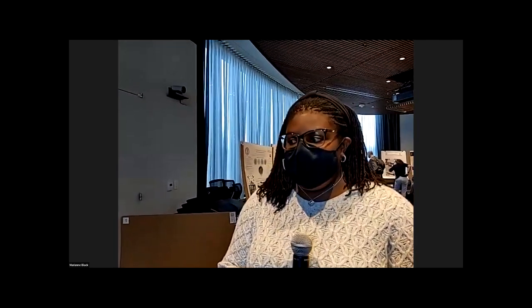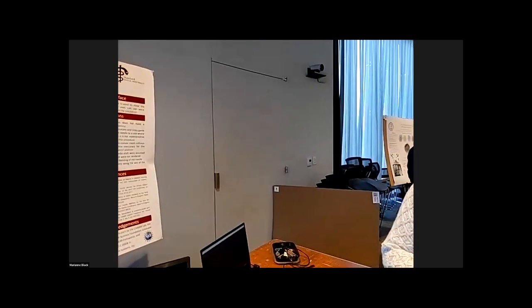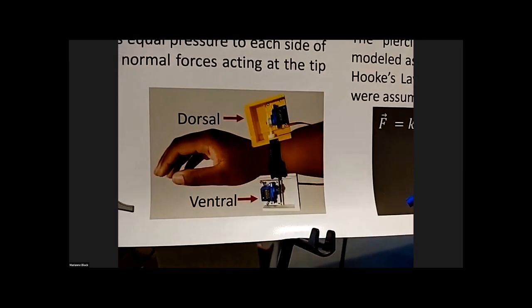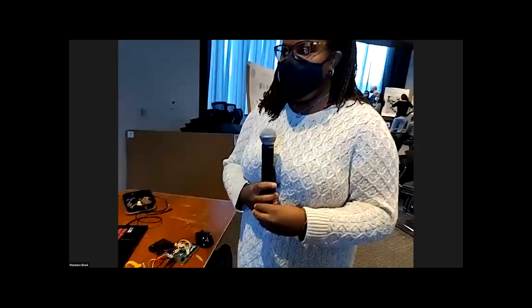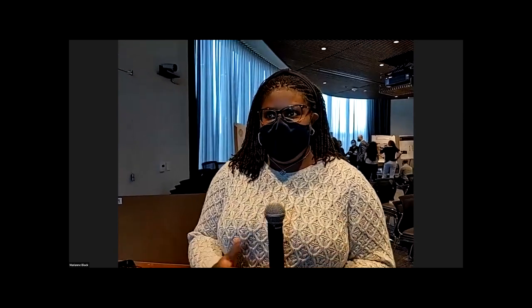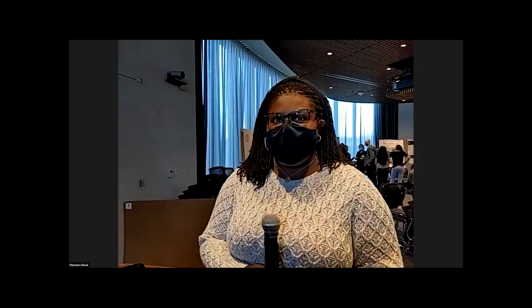I'm also looking into different ways to mount those devices I showed you to be more wearable and more robust. And then I've also looked at other types of devices that provide shear forces to the skin, so that you can add another degree of freedom of feedback. And also I've looked at devices that add torsional degrees of freedom to the skin. Those are still in development, and whether I have the model to accurately determine what forces go to which degree of freedom is something I'm still working on as well.